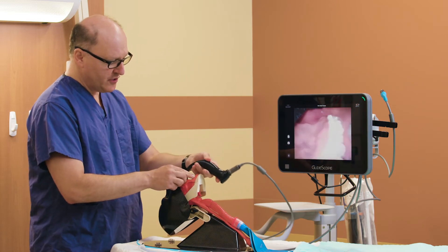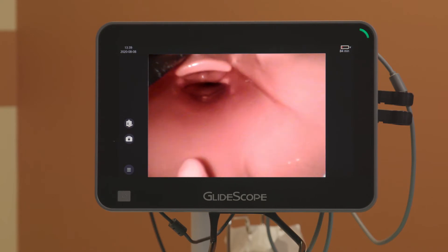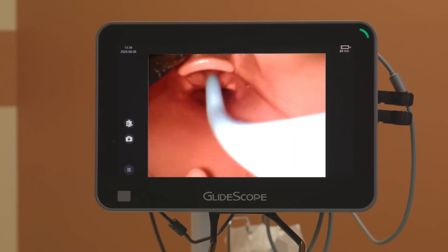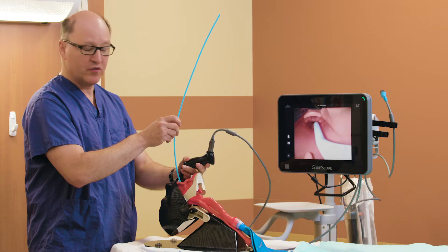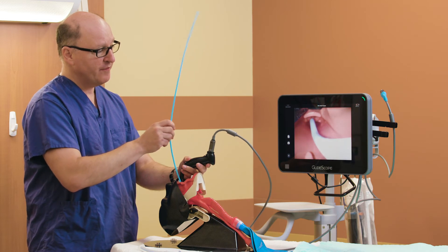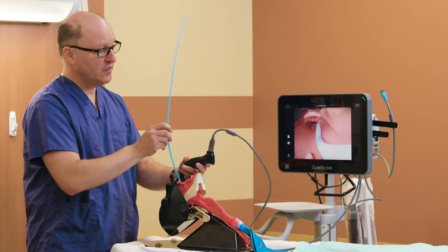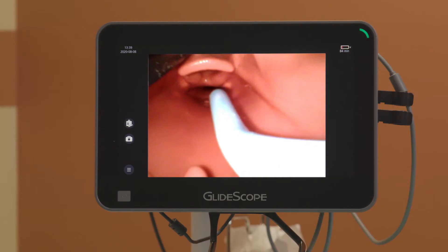On insertion of the blade and getting our view again on the monitor, I can now take this bougie and come up over the notch. Notice the bougie has a small outer diameter — it's only five millimeters. Relative to a tracheal tube which is twice as large, there is improved visualization. There also is a lot of manipulation possible and it is more forgiving in a tight space.